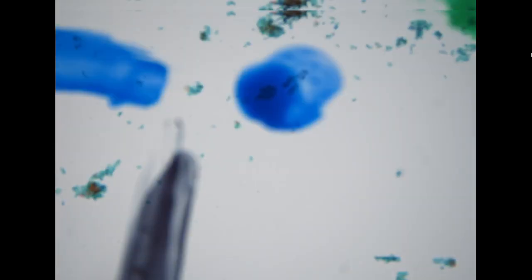Based on the morphologic pattern, I think we can only call these ASCUS, right? Because there are no unequivocal koilocytic cells, and the nucleus is not particularly hyperchromatic, just a slightly increased NC ratio and slightly darker staining. So the case is signed out as ASCUS.